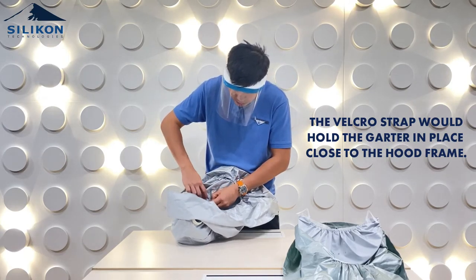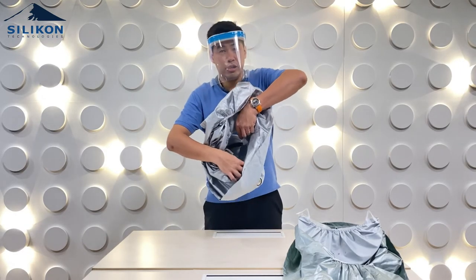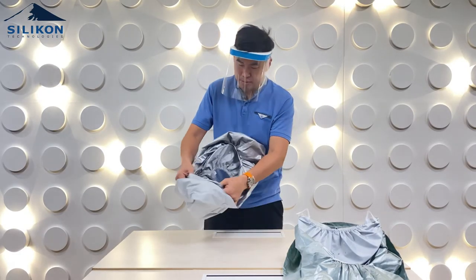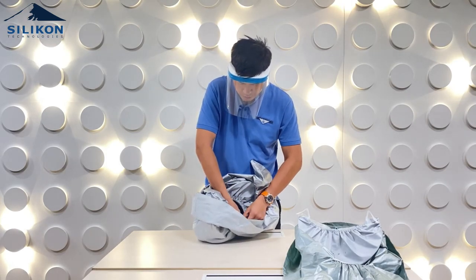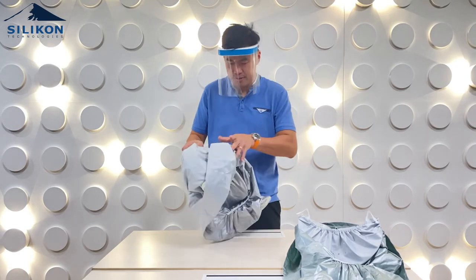There's a garter strap inside and there's a hole on the hood harness — the harness is the gray one. There's a hole on the harness; you just have to push it in and then tie it with the velcro strap. That's it and you're done.